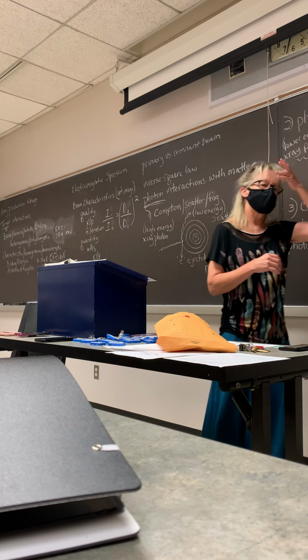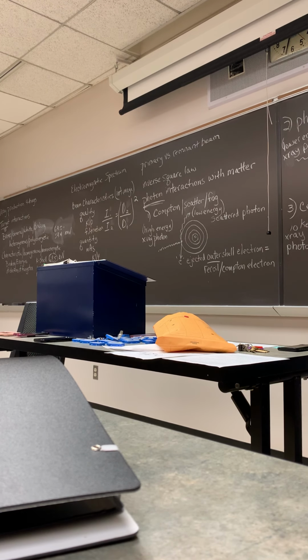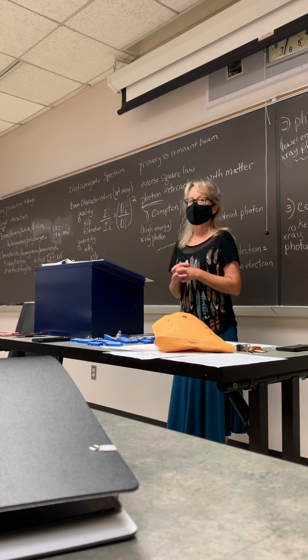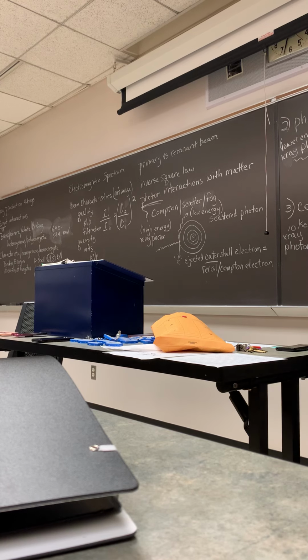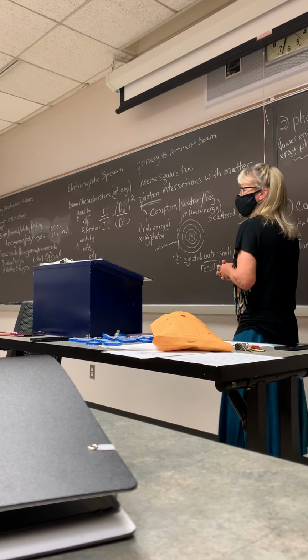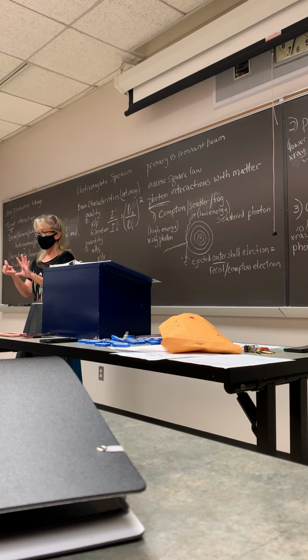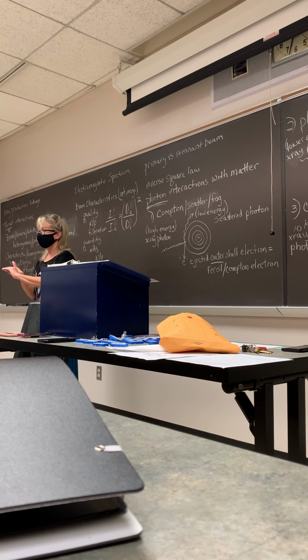Okay, then we need acceleration. We need the electrons to travel from cathode to anode. What does that? High voltage circuit. So we need them to accelerate. So the high voltage circuit pulls the electrons across the tube, and then we need deceleration of the electrons when they hit the target. Okay, thermionic emission, keep them in a focusing cup, acceleration and deceleration.